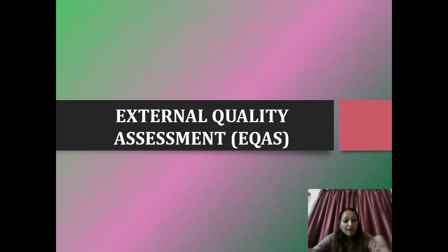Apart from this, before we go to the external quality assurance, I'd like to recapitulate that in the previous talk, we talked of many ways of assessing performance qualification. For the internal quality materials that we run, the CV percentages need to be calculated, and we have to see whether there is any deviation constantly happening, whether we are getting a high CV percentage value. Moreover, the second aspect of today's talk, the external quality assessment, is a very, very integral part of performance, which actually signifies how accurate our test results are when we compare with others of outside labs. So the total error assessment, taking into account the imprecision from our CV percentages and the inaccuracy from our external quality assessment results, accounts for the total allowable error.